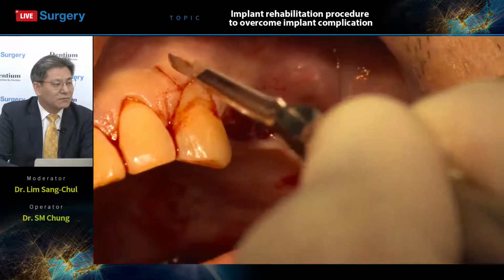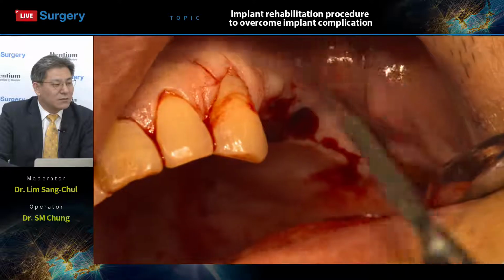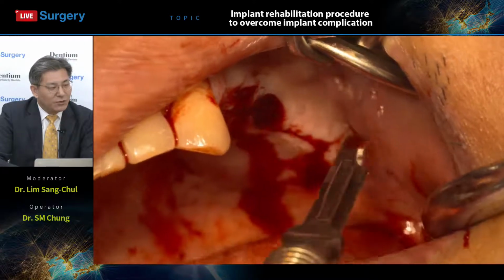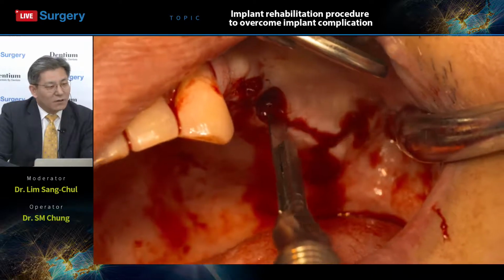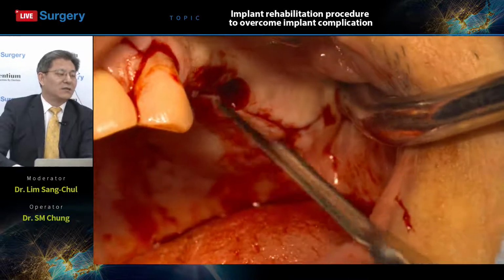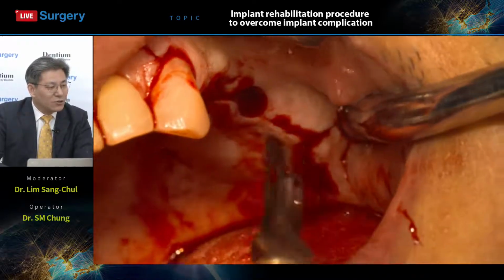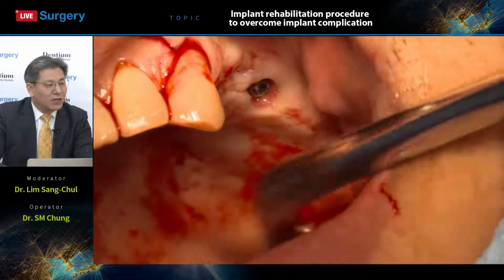And to confirm a clear cut of the incisions, he prefers to use the back portion of the scalpel instead of the blade. He doesn't use the blade of the scalpel. Now he is using the back portion of the scalpel, cross-checking the clear cut.